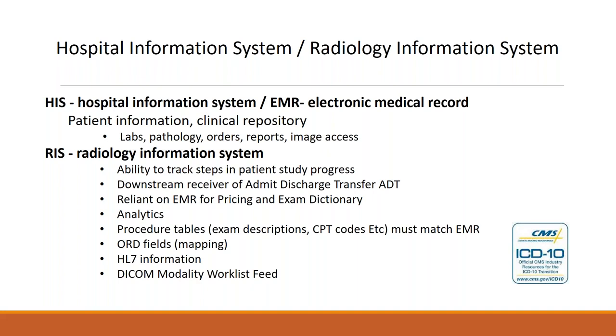So it's very important that you interact with other departments. IT bridges all of these other ancillary departments together because of the interactions, the interfacing, or the integration. A couple of things here: ORD fields refer to mapping, HL7 information, and the DICOM modality worklist feed. We'll cover a little bit more of that in a moment.